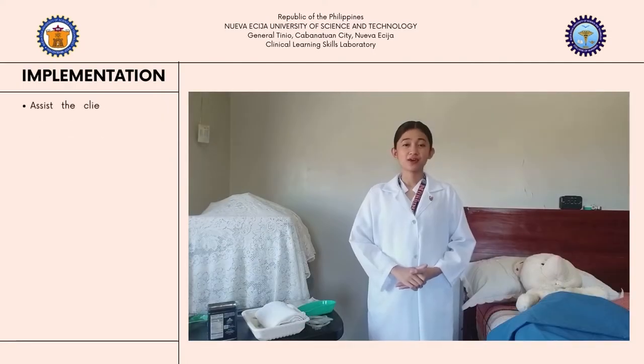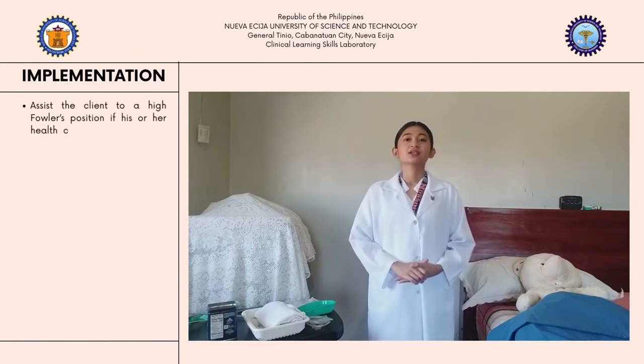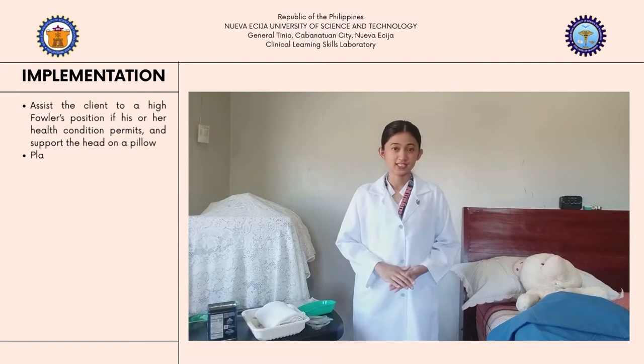Next, assist the client to a high Fowler's position if his or her health condition permits and support the head on a pillow. High Fowler's position will help facilitate the passage of the tube with the assistance of gravity.